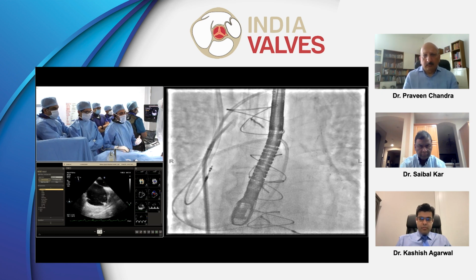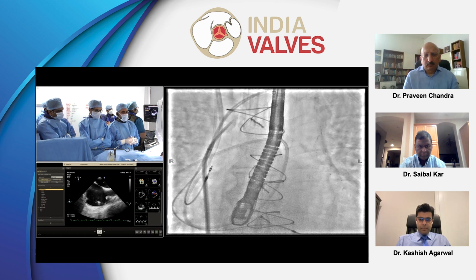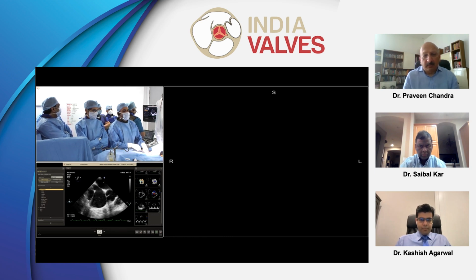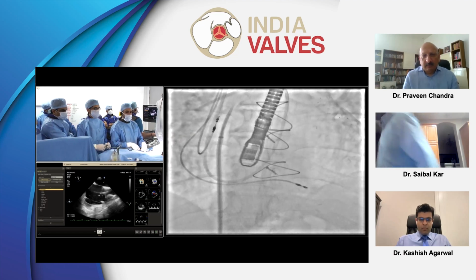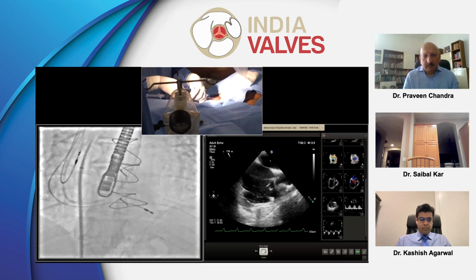Ravinder, so I think maybe we can discuss more, but that's what we have selected here. Prashant can do a live measurement of the PML. So if you allow, can we go ahead and start the septal puncture? Please carry on. Okay, this is an SL1 sheath. We're going to come down. You can see the bicaval view. Can we have the echo pictures, please, in front of the small slave monitor?